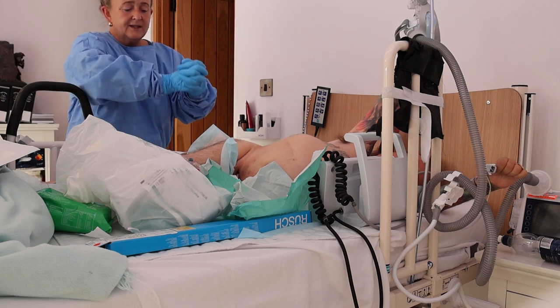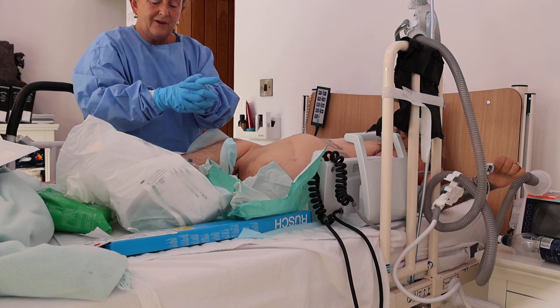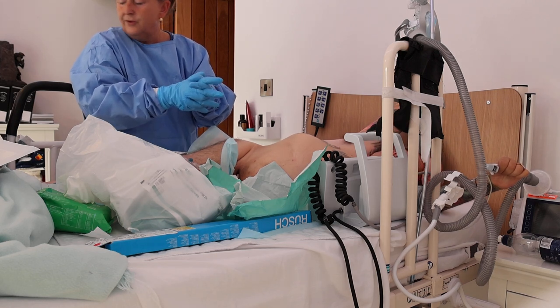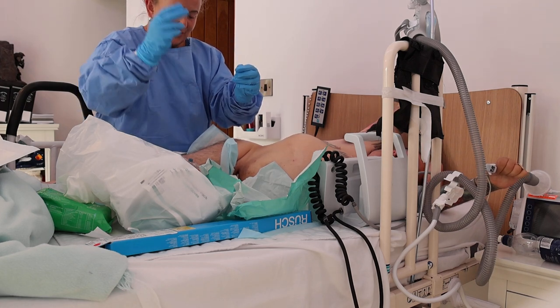So when you've got your sterile gloves on, you're ready. I'm ready to have one hand dirty and one hand free. But sometimes I have to put an extra glove on to change. And they're already ready here. Are you ready? So first things first. This is my dirty hand.